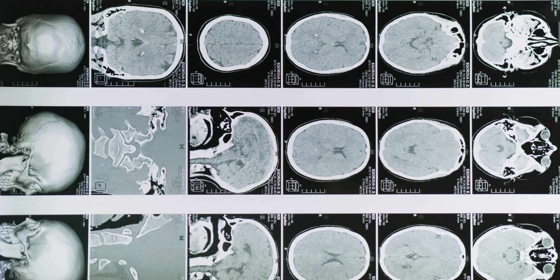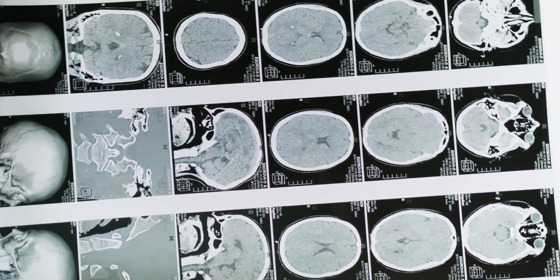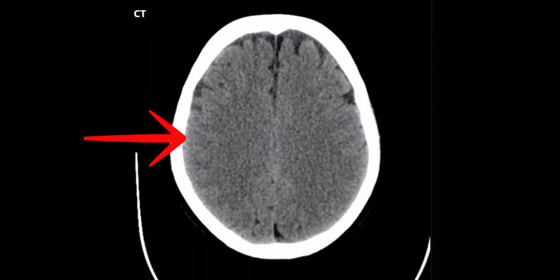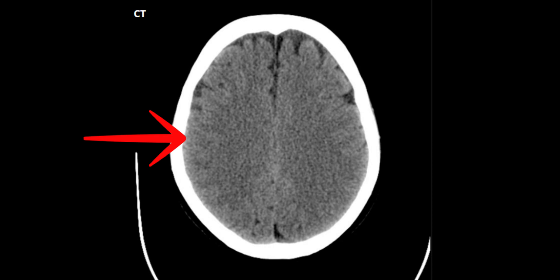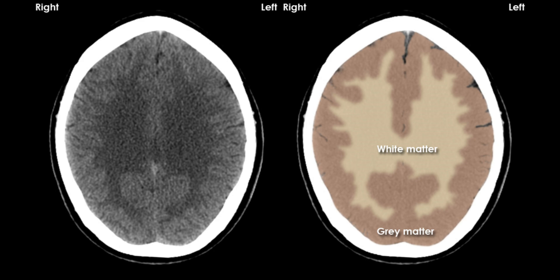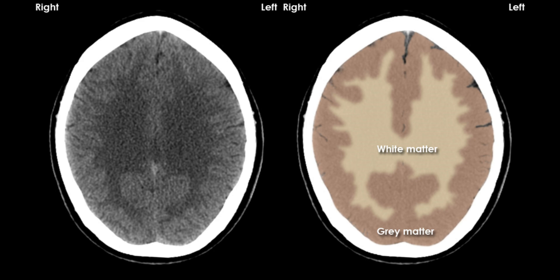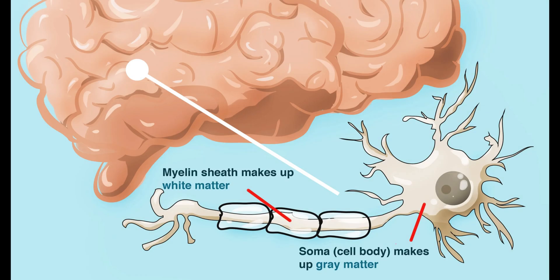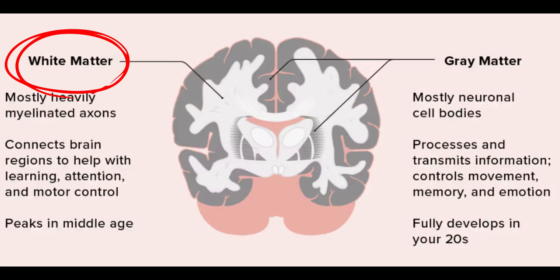Now let's visualize it on a CT scan. This here, the part of the brain lying in the periphery is the grey matter, and this part in the center appearing a bit dark is the white matter. Here is a simplified diagram. Now that we have discussed and understood the fact that white matter is composed of axons and lies centrally in brain parenchyma.